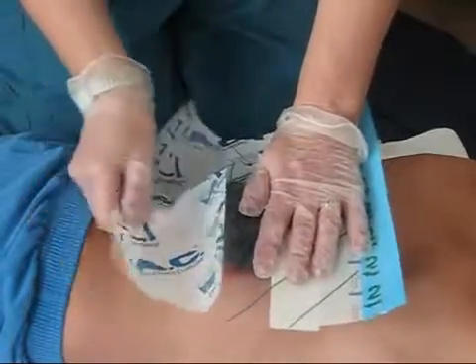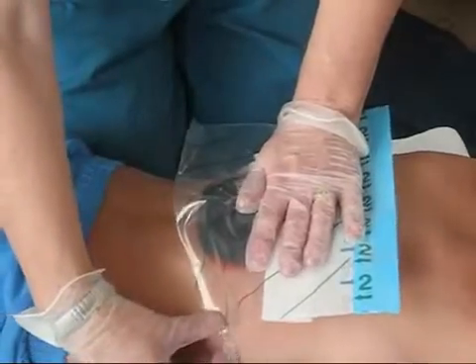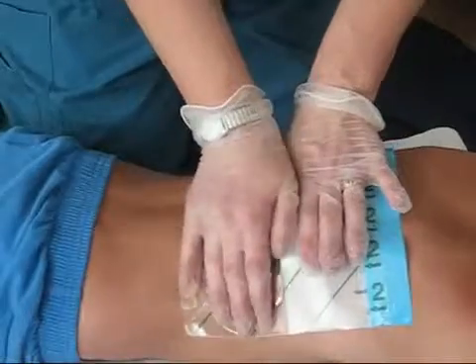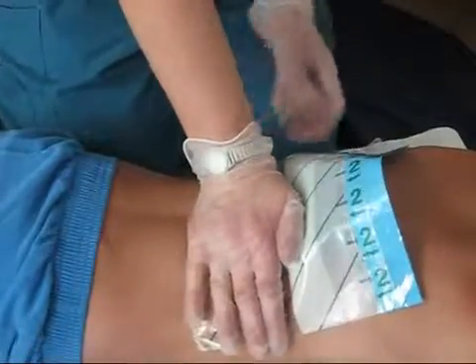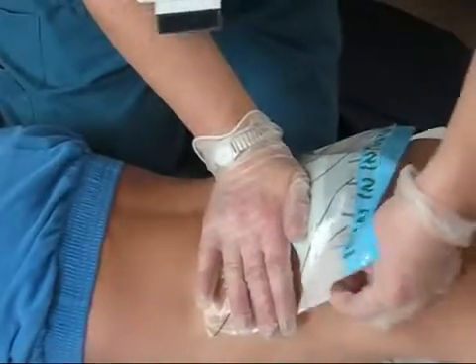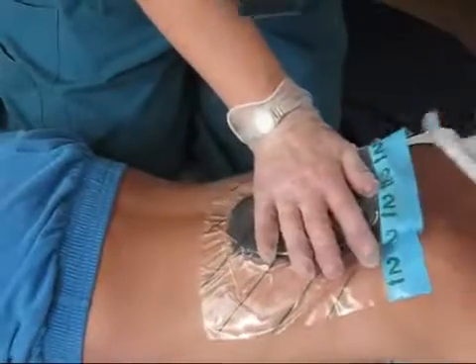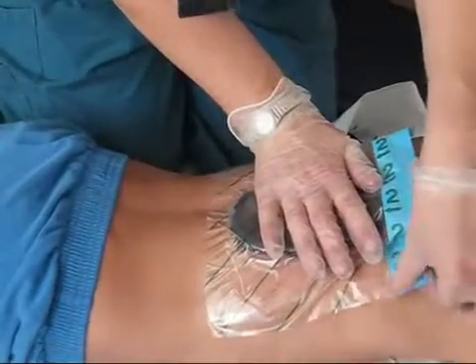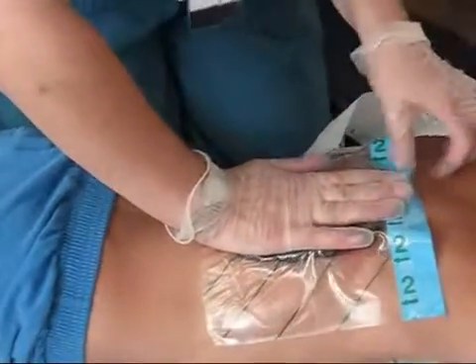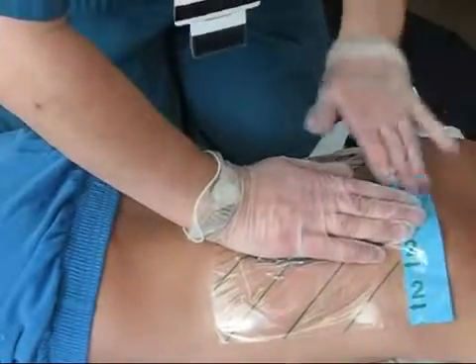You'll remove the first layer, and make sure your patient is pre-medicated, because this will be very uncomfortable. Make sure they have enough pain medication. At this point, the main focus would be to get the seal on the top of the wound, and you can worry about the edges afterwards.